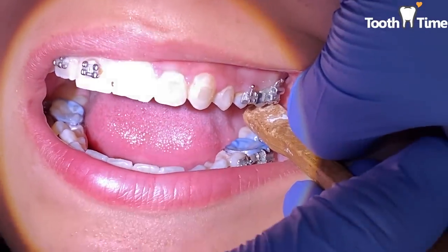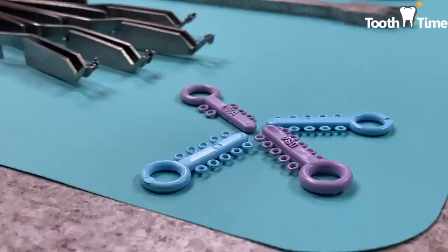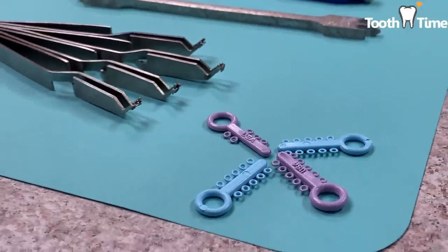Now we're going to go ahead and reposition the brackets. We went ahead and removed the brackets, and now we have to remove the glue, which you'll see being done here.